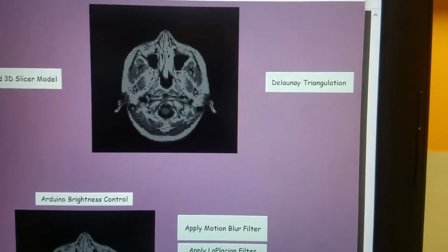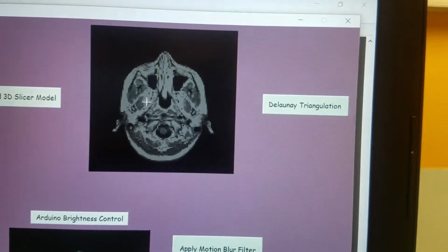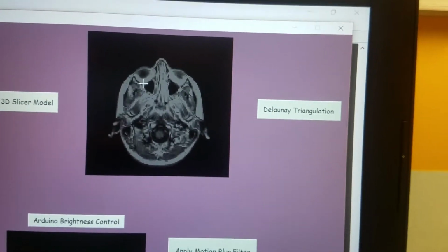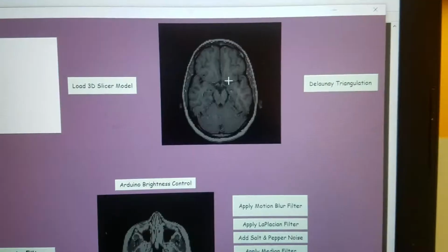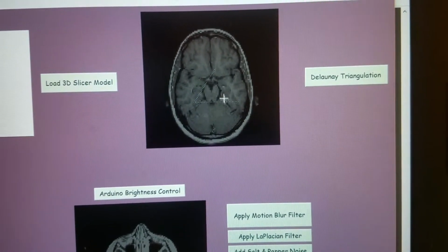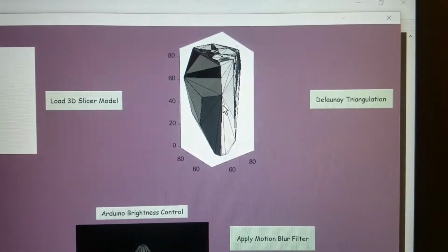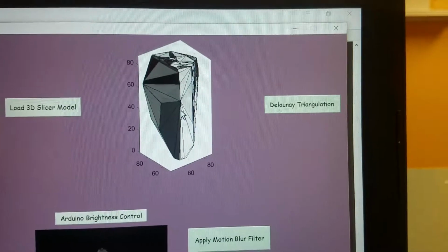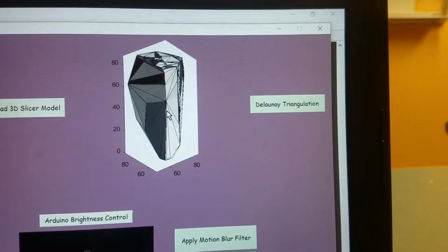So for the Delaunay triangulation portion of the GUI, we press that. It'll bring out a cursor and start to draw, and then press enter to move to the next slice. I've got 10 to go through, so I'm going to fast forward on this. So here's the last slice that we have to do, so I'll just do another 2 here, and then press enter, give it a second, and we'll end up with this rather strange looking triangulation, but regardless, that's the Delaunay triangulation portion of the GUI.